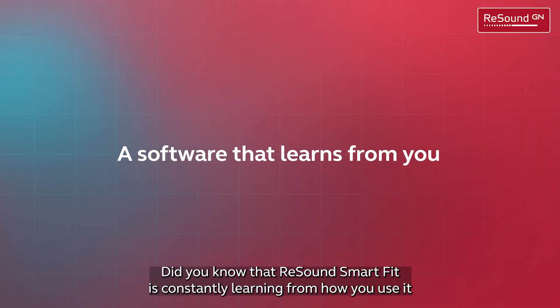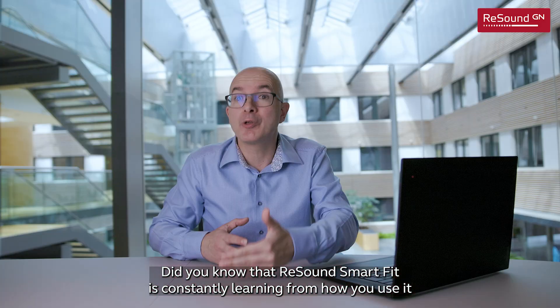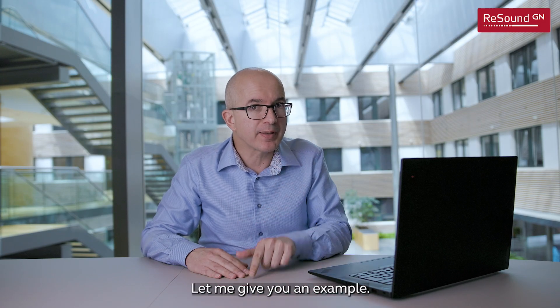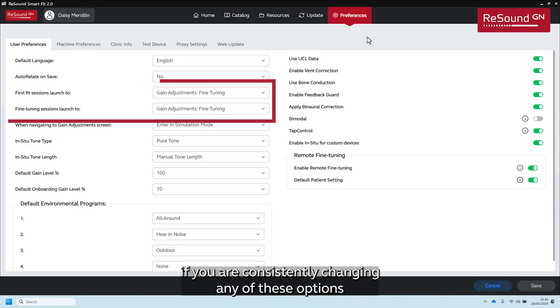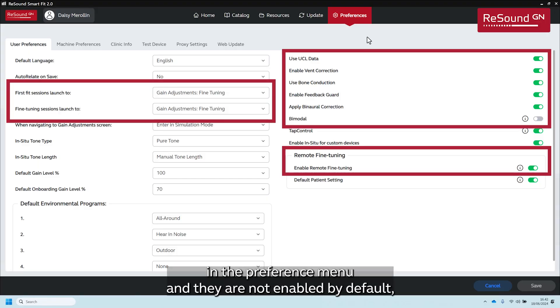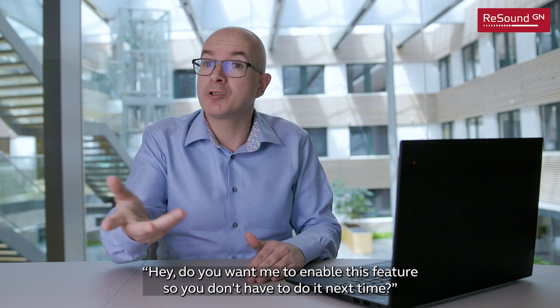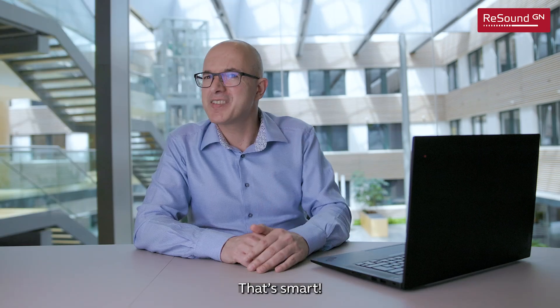Did you know that ReSound Smart Fit is constantly learning from how you use it and will automatically adapt to your preferences? For example, if you are consistently changing any of the options in the preference menu and they are not enabled by default, the software will show you a message saying, 'Hey, do you want me to enable this feature so you don't have to do it next time?' That's smart!